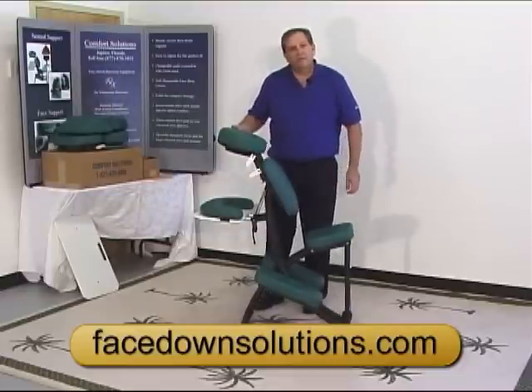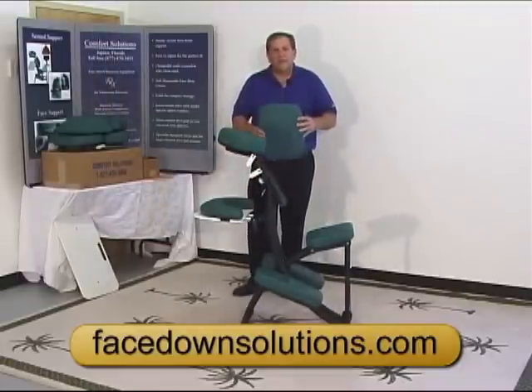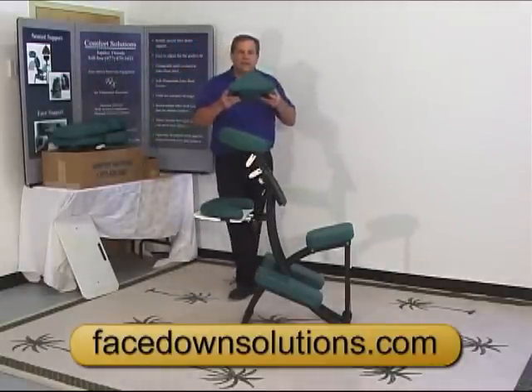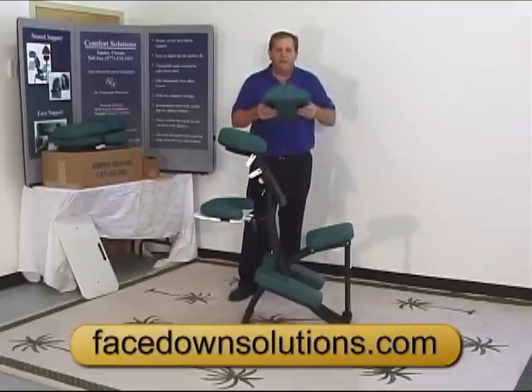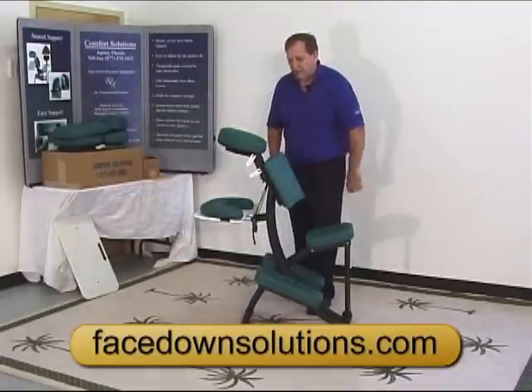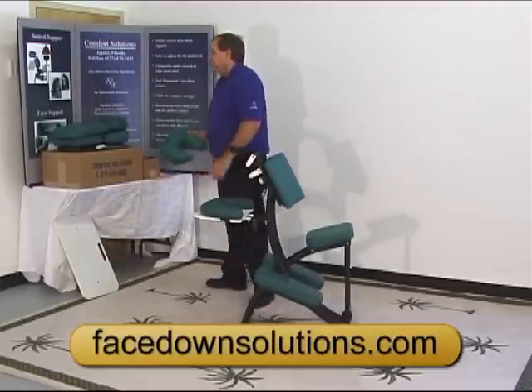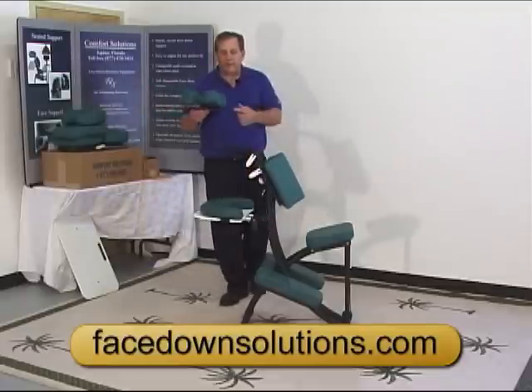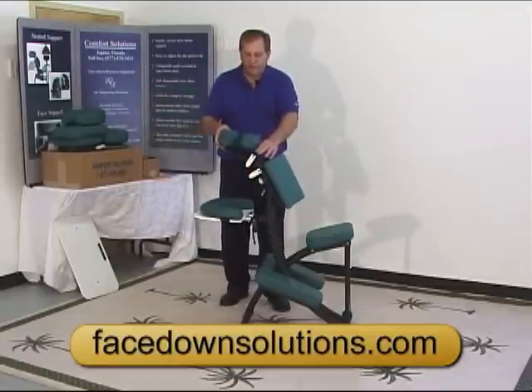Let me show you the extra pads now. Like I said, all the pads are Velcroed on. The chest cushion can be replaced by the sternum pad — large-chested men or women sometimes find this more comfortable. It can be used vertically or horizontally and just sticks on just like that. We also have the three-piece face pad, which you'll want to use if you're wearing glasses. That has a black plastic backing plate that just sticks on in place of the other crescent cushion.